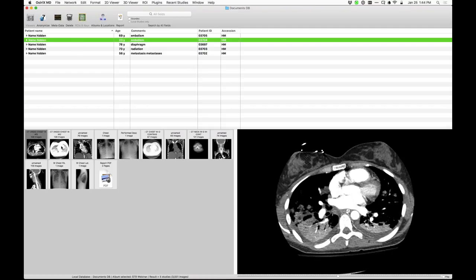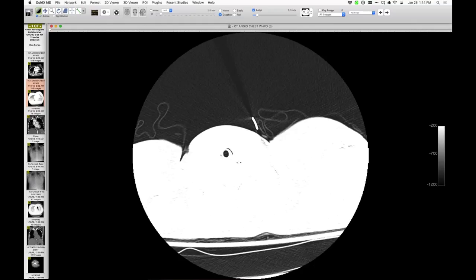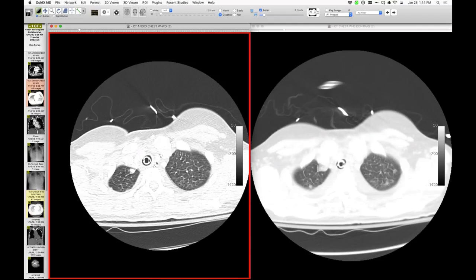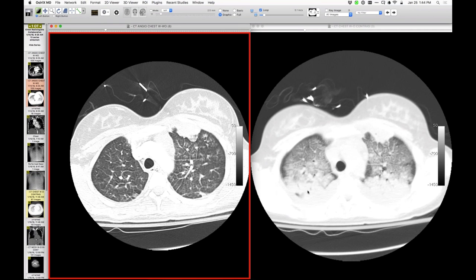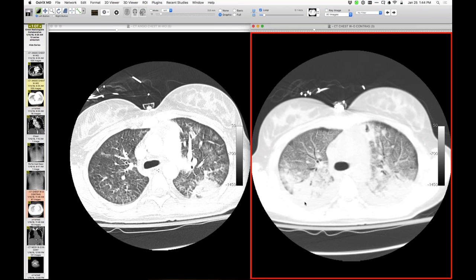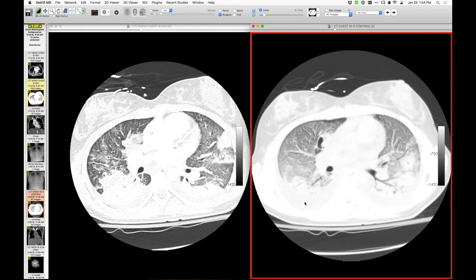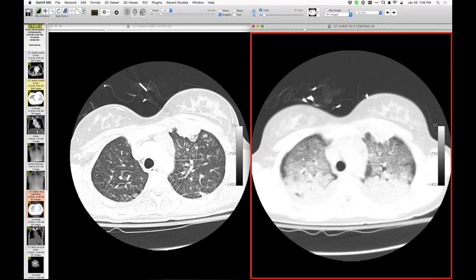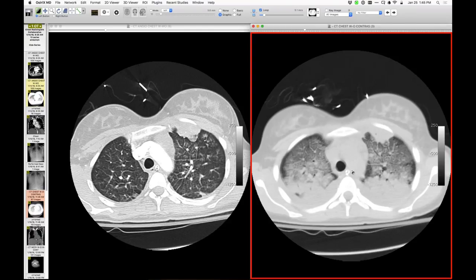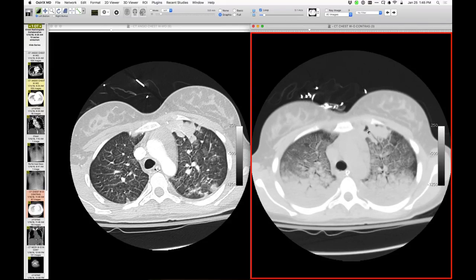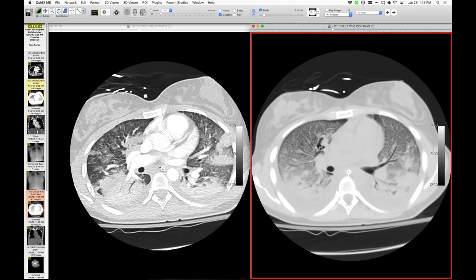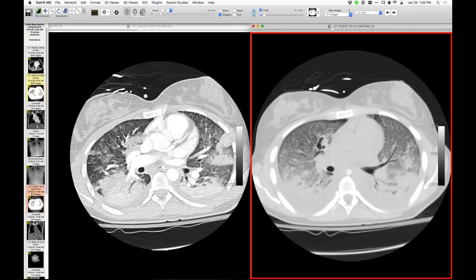This young person came from an outside hospital, very ill. Two days apart on the chest radiographs — she has diffuse lung disease with pulmonary edema, either iatrogenic or sepsis-related. There are focal opacities in the lungs, and over time an area of cavitation develops within one, with another rounded opacity also cavitating. Findings are consistent with septic embolism.